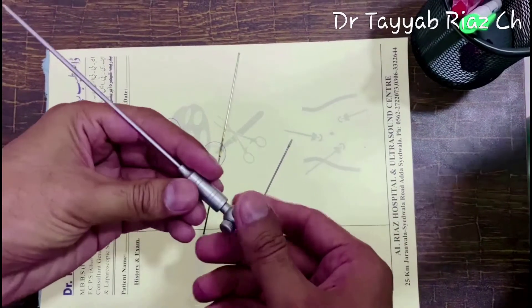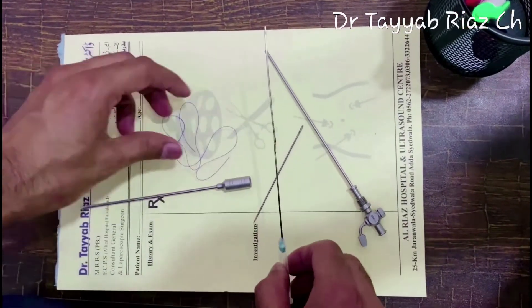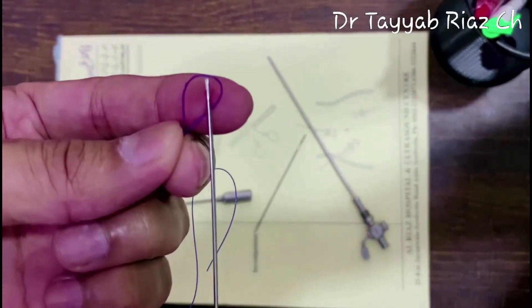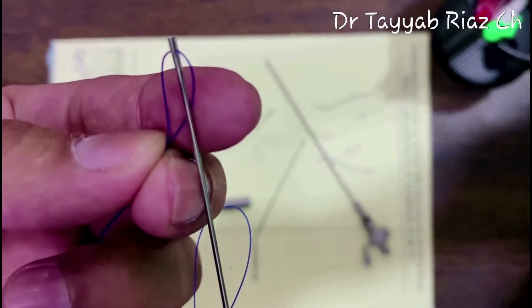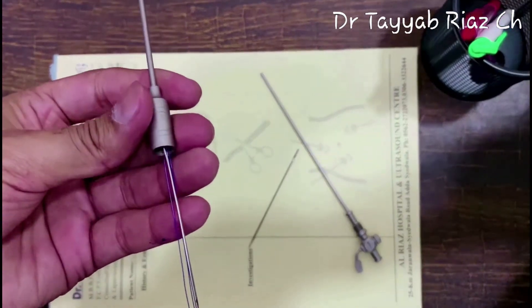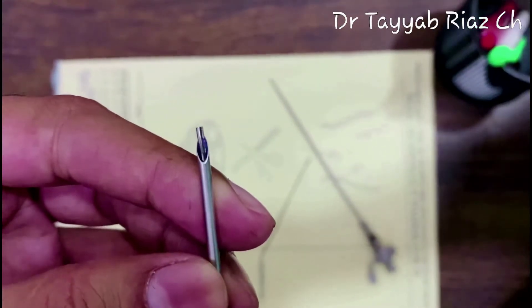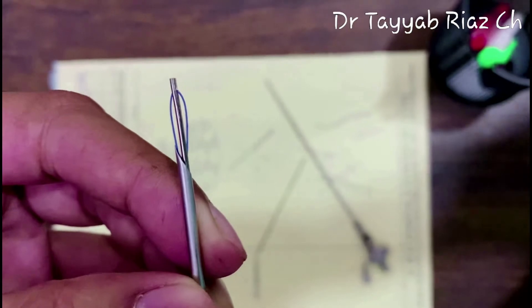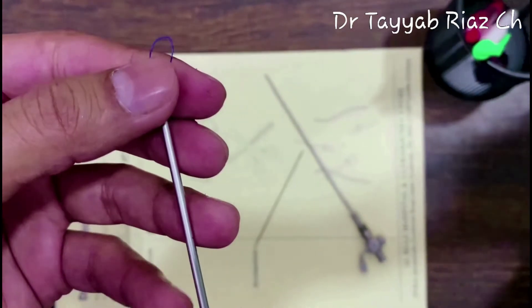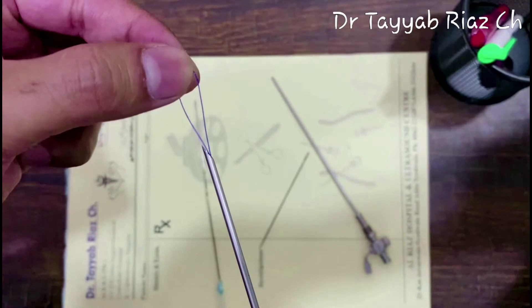To perform this procedure, first remove the inner stilet part of the Veress needle so only the outer needle part is used. Then take a full-length thread, make a loop at the center, and feed that loop to the groove of this loop passer. Grab both ends of the thread with the right hand, insert the loop passer at the upper end of the needle, and it will come out at the lower sharp end. Then, with a grasper intraperitoneally, grasp the loop and remove the loop passer. You can then feed the tip of the appendix through this loop and perform your maneuvers.